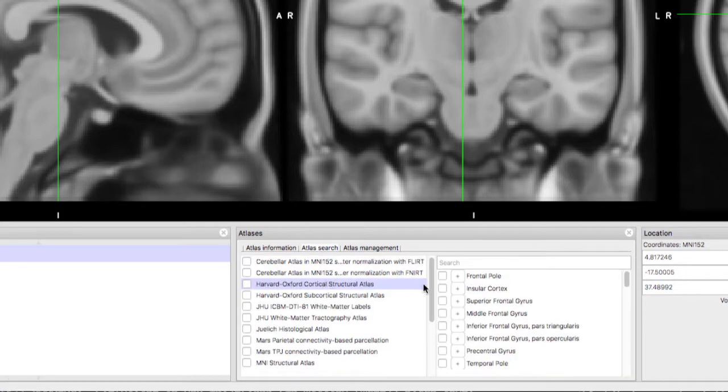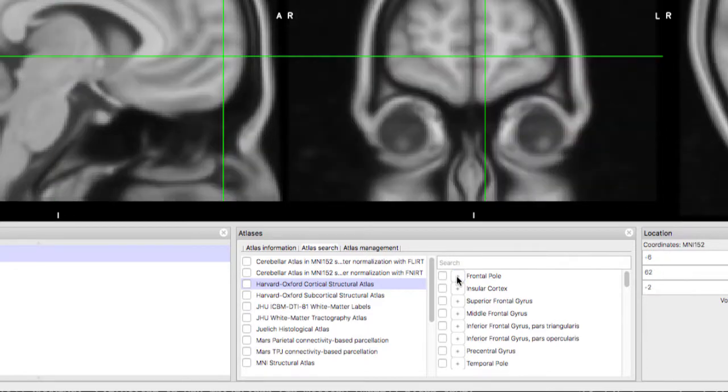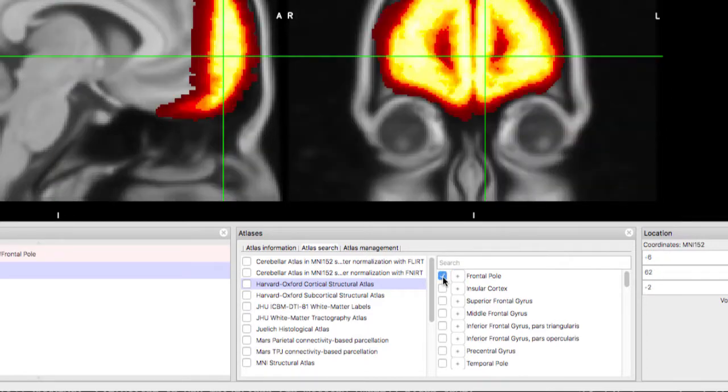Clicking on the plus symbol places your crosshairs in the center of that structure, while checking the checkbox displays it.